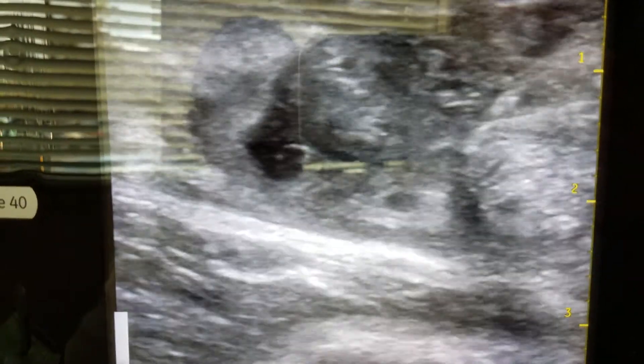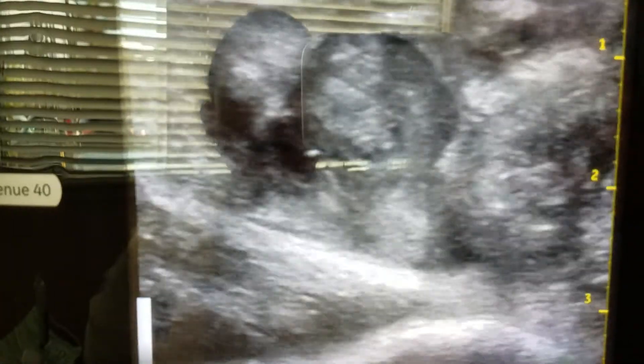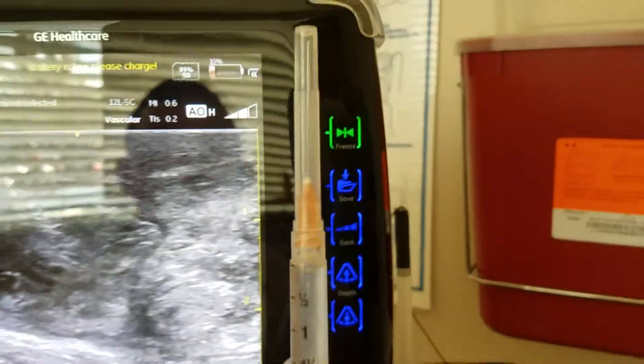We'll go from there with the scar tissue. You can see the retraction. I'm going to point his toes down — as you can see, we get the gap closer. After I put the stem cell in, I'll do what we call plantar flexing, but right now I'm going to leave them in neutral so I can get the stem cell in.